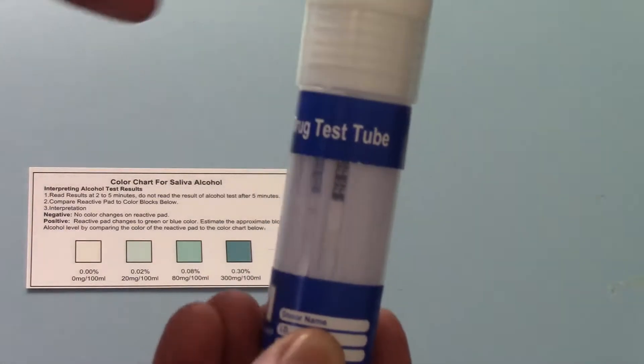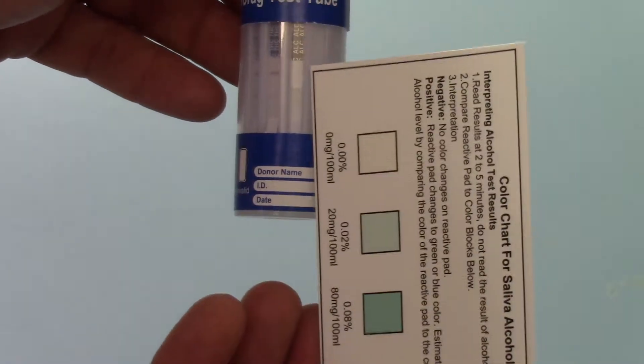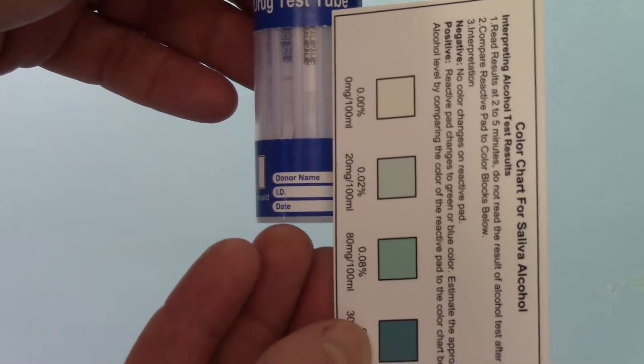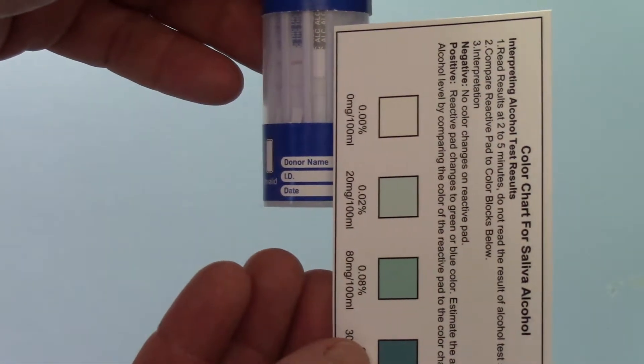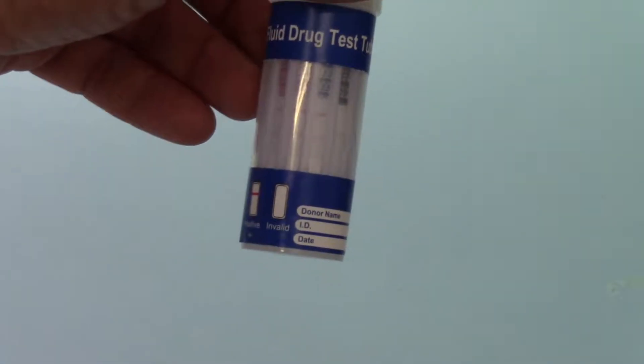So let's read that one first. We're looking for a comparison against this color chart and this one is very clearly all negative. There's no blue discoloration on that one at all, so that does not indicate the presence of any detected saliva or blood alcohol.